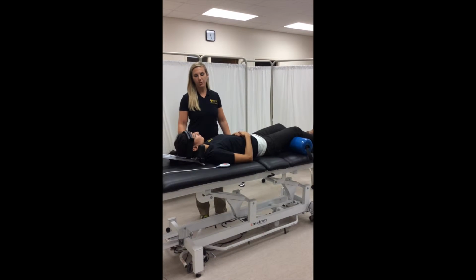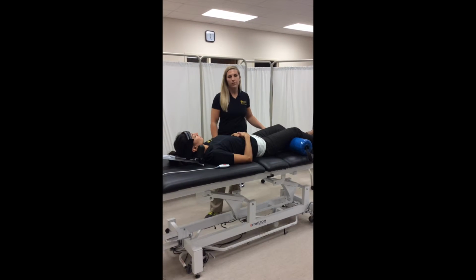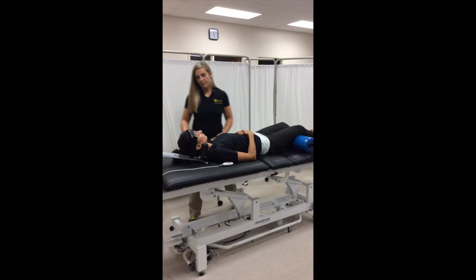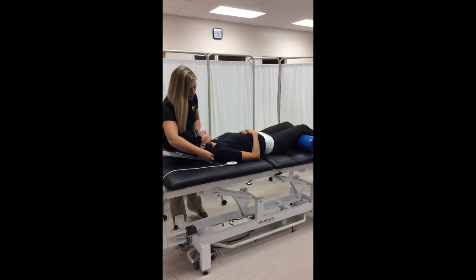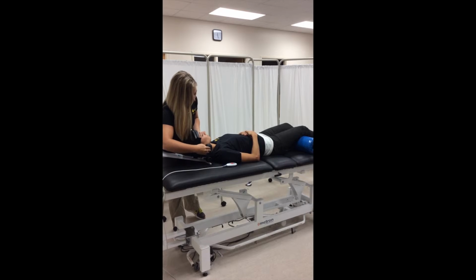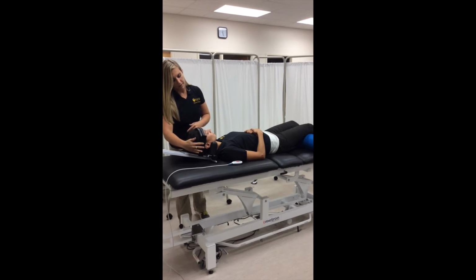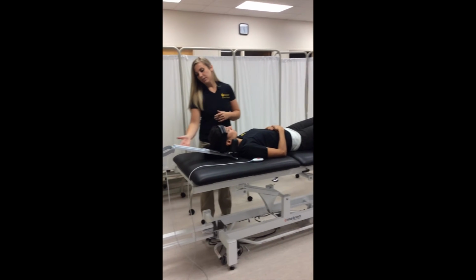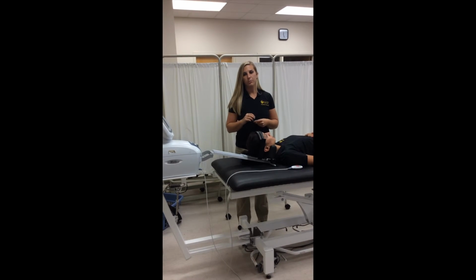Okay, so to start the treatment, I'm going to have my patient in a supine position. We are going to have a bolster under the knees to help promote relaxation, and since this is a split table, I'm going to make sure that it's locked. We're going to have the patient's head, her occiput, right on these pads, and you can go ahead and tighten it, and you want to make sure that it's snug but comfortable, and we have a forehead strap, and we're going to have this snug but comfortable to make sure to keep the head in a neutral position. This is in slight flexion because we're working with muscles, so we can't really pinpoint a cervical position.